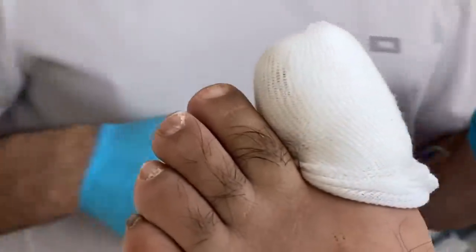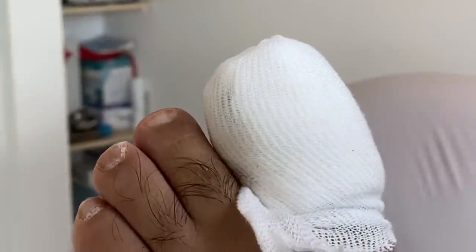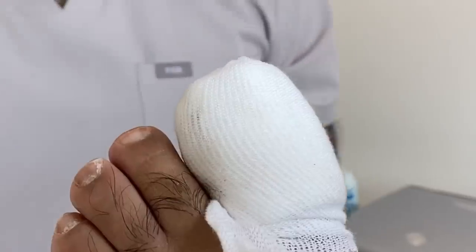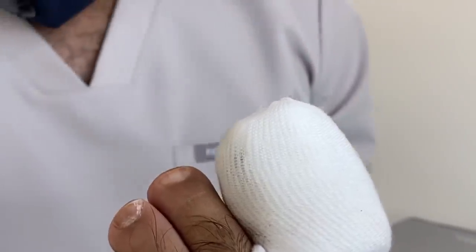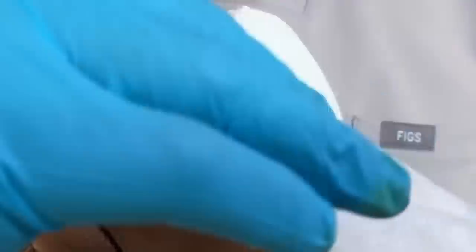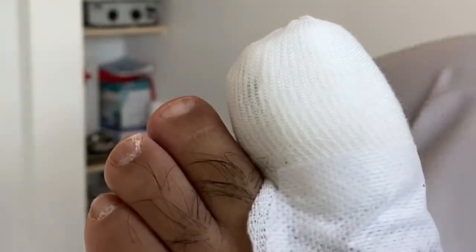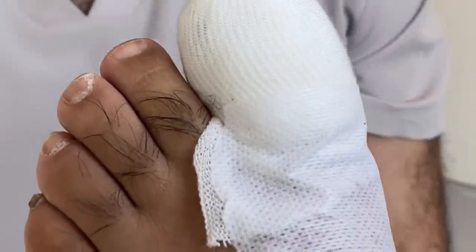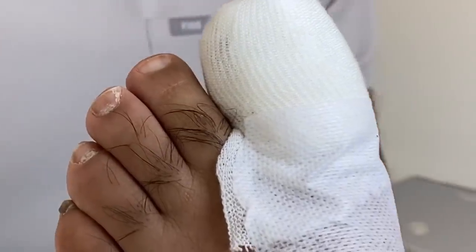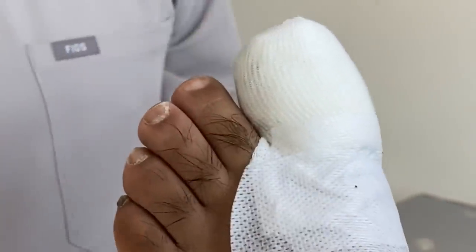And voila — that is how you do a partial nail avulsion. Thank you.